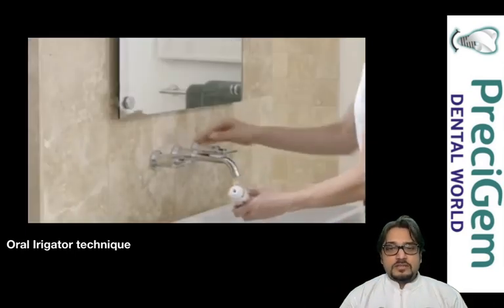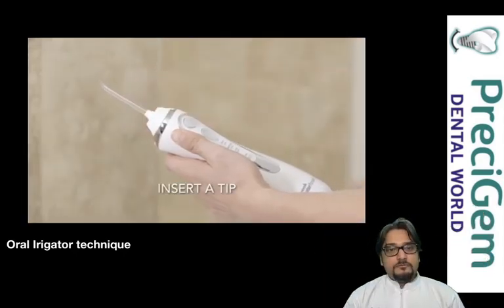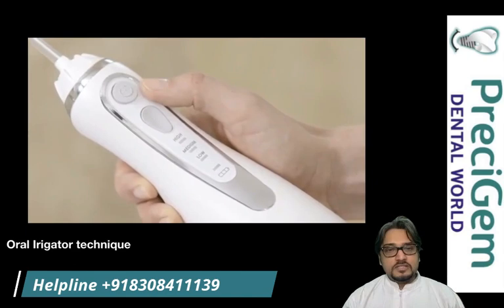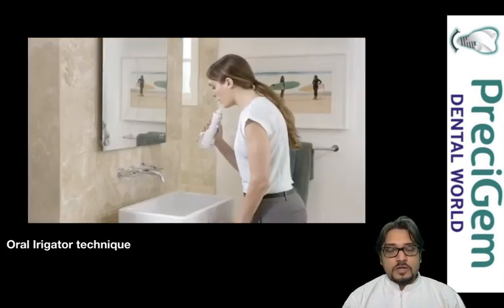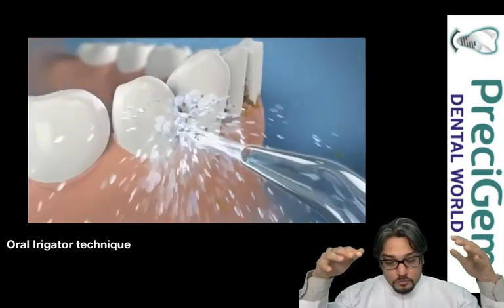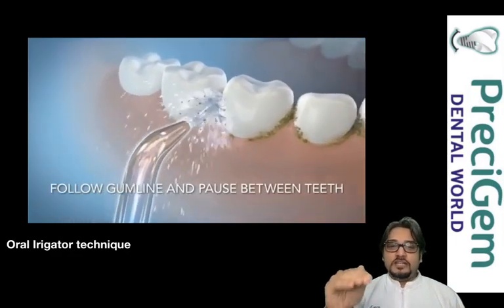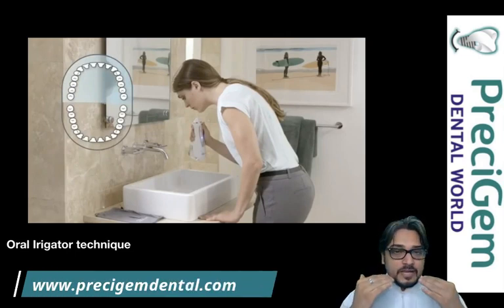This is a chargeable oral irrigator — the best type is a water pick. You fill the tank with clean water, then insert the tip of the irrigator. There is an eject button to remove the tip. Once the tip is inserted, a button lets you start and select the pressure — low, medium, or high. Sensitive patients can use low pressure. When you press the button, the water jet targets the junction of your teeth and gums, removing plaque from areas not easily reached by a toothbrush.